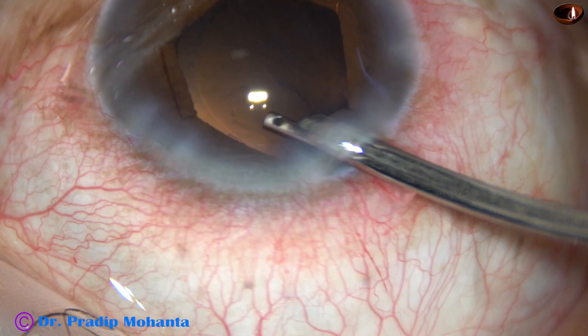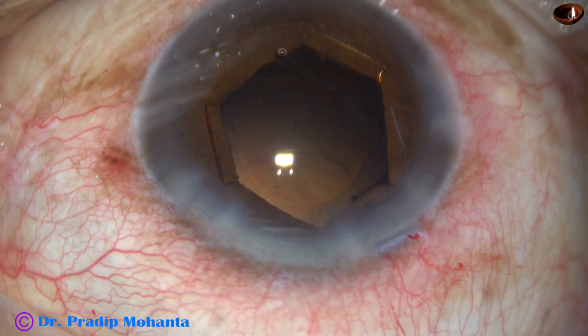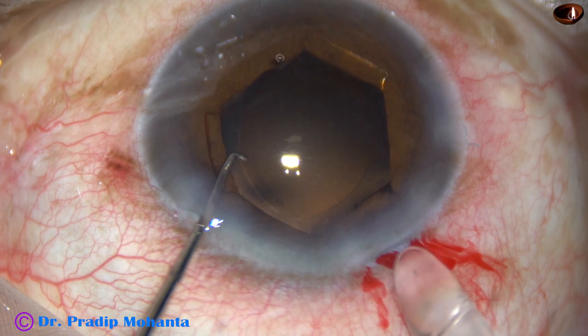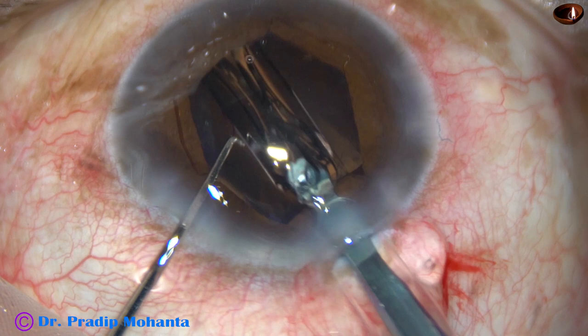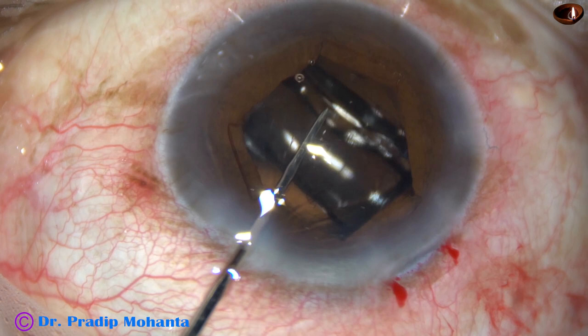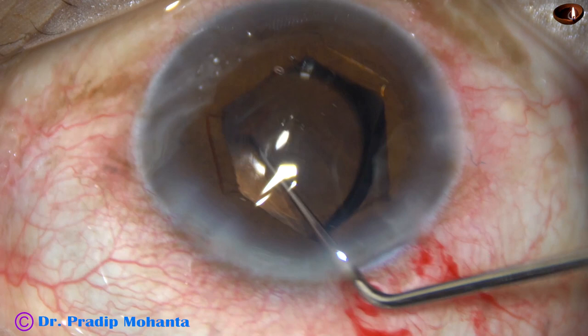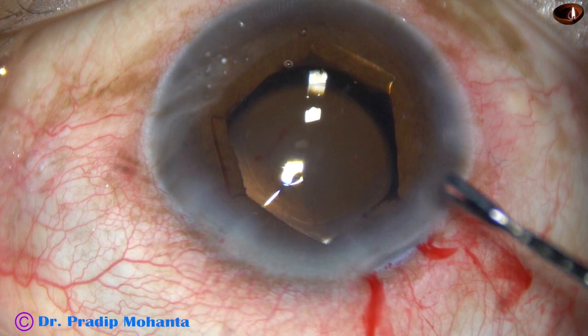Visco is injected and a hydrophobic acrylic single-piece monofocal intraocular lens is being implanted in the capsular bag. The lens has gone into the capsular bag. The lens is dialed so that the haptics are about 90 degrees away from the main incision, so we can go behind the haptics for cleaning the visco.